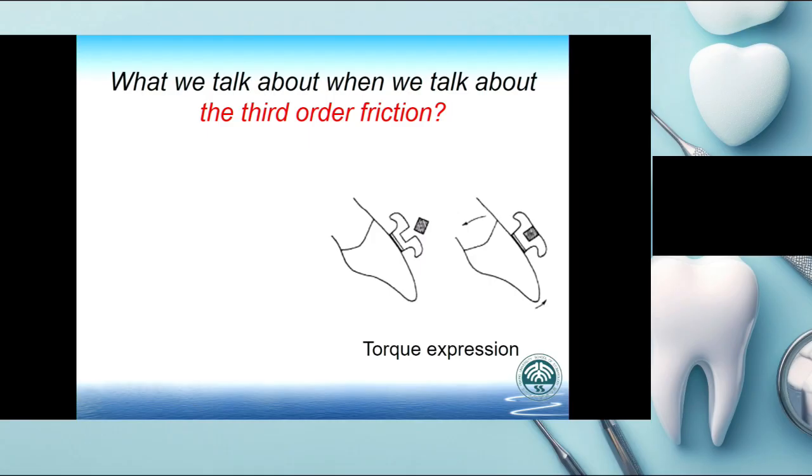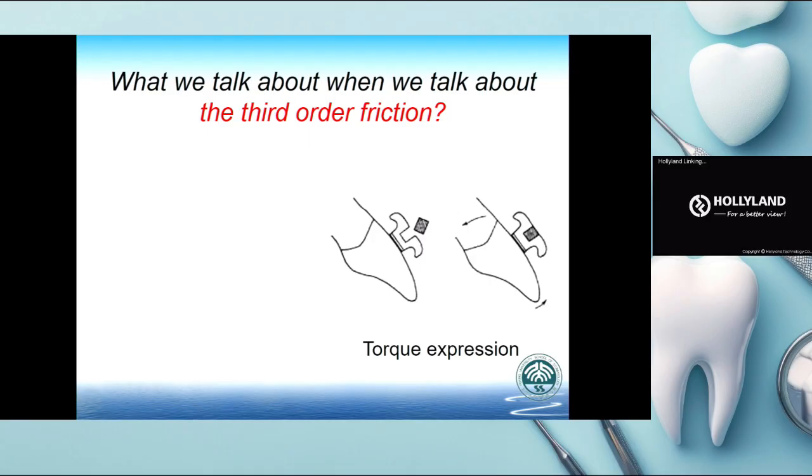So when we talk about the third order friction, basically we are talking about the torque expression, because friction is a necessary condition for torque expression.